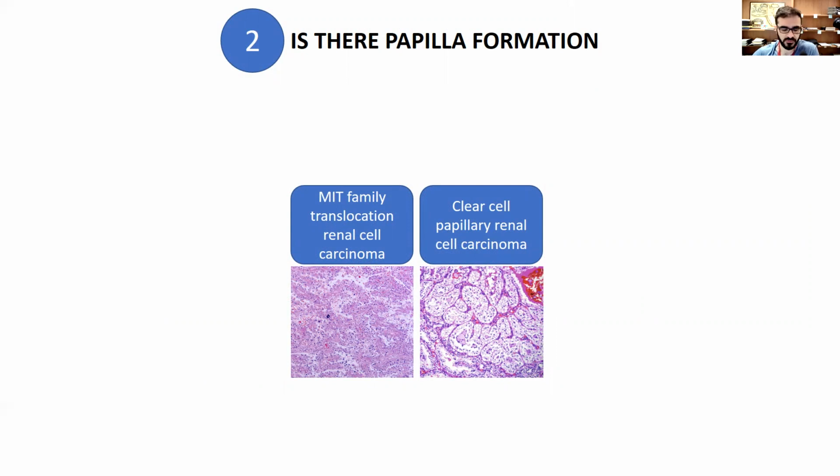Again, papillary renal cell carcinoma might have clear cell cytology, and there are rare reports indicating that there might be some true papillae formation in clear cell renal cell carcinoma. But if you encounter a tumor showing predominantly clear cell renal cell carcinoma morphology, and you are questioning some areas about papillae, it is probably pseudopapillae. It's not the true papillae.